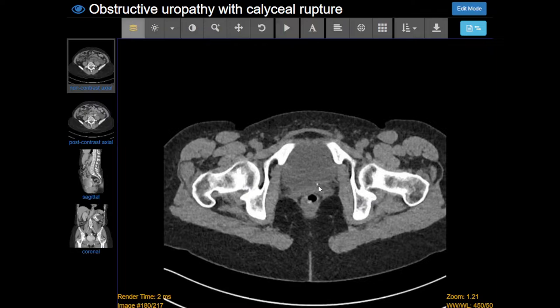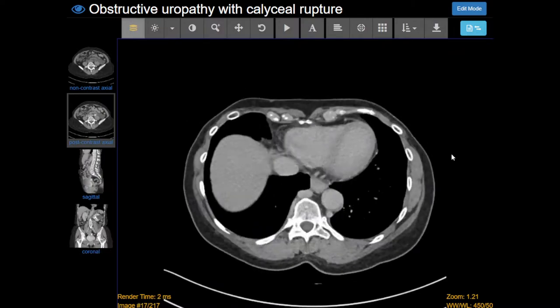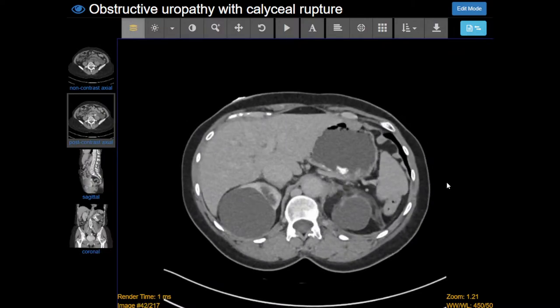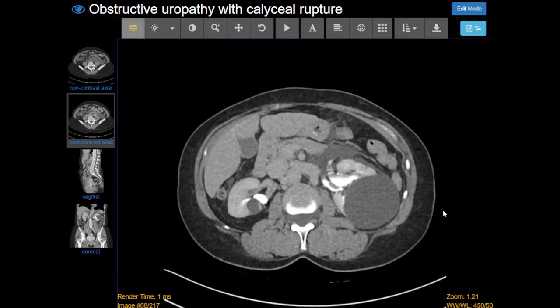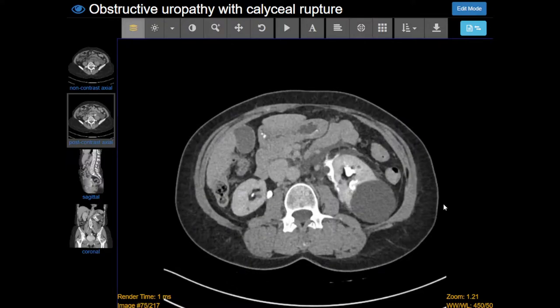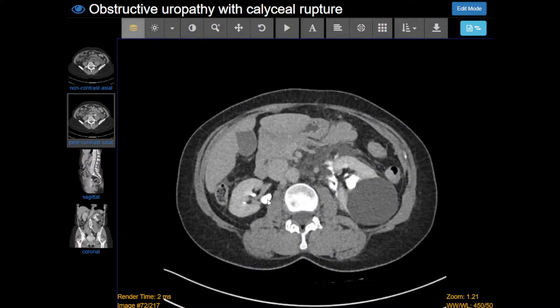One way we can confirm this finding is with a post-contrast scan, and in this case we've done a urogram. We've given contrast in two different boluses and imaged once, so that first contrast bolus has made it all the way to the renal collecting systems, and the second bolus is in the kidneys. So we're able to see enhancement of the kidneys and the collecting system.